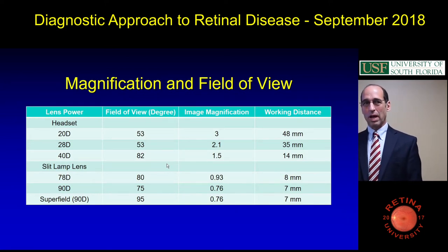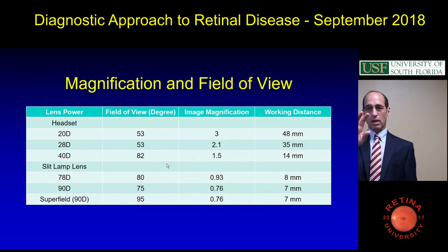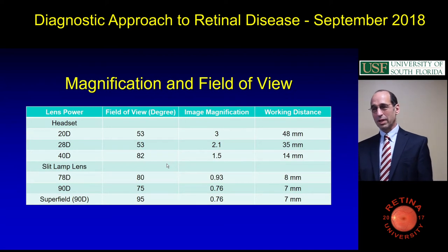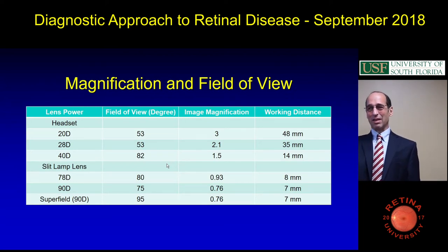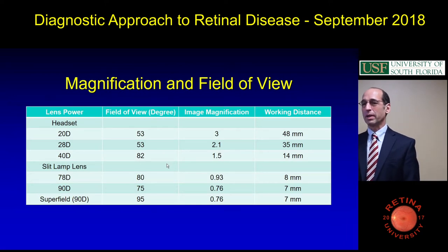I know some retina people, and I try this sometimes, where they'll actually look as the eye's moving, so they don't miss anything. But it can be nauseating, literally. So if you have somebody look up and then look to the right and look as it moves, you sweep the eye a little bit.